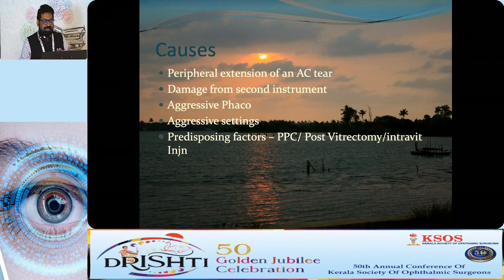It's always a better idea to avoid such situations as much as possible. So it could be a peripheral extension of an anterior capsular tear, or an incomplete rhexis, or going in for a wraparound PC tear. It could be from a second instrument, so always be careful with the second instrument not to cause damage to the capsule, anterior or posterior.